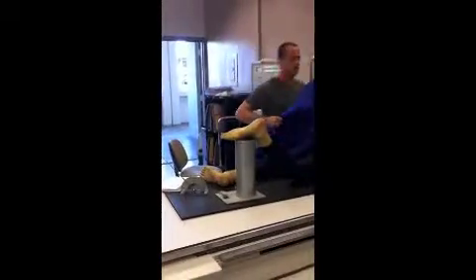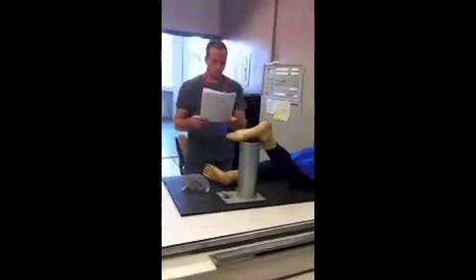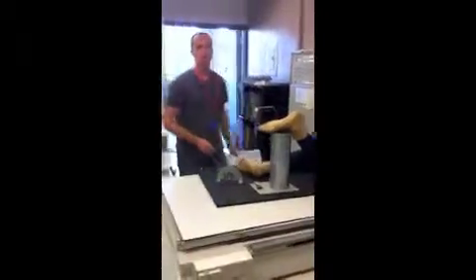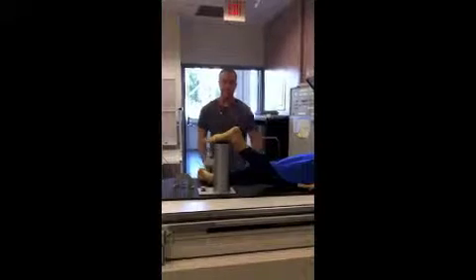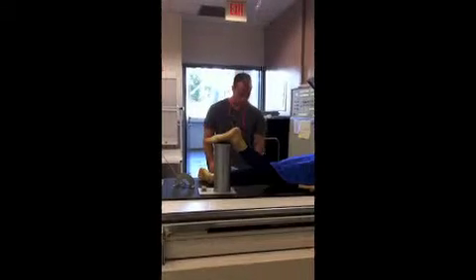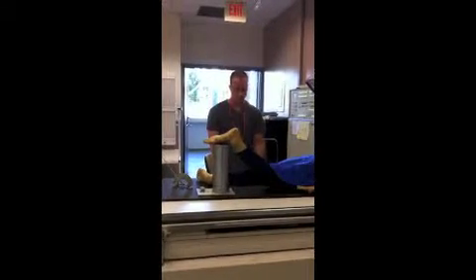Again, shielding the patient as much as possible. And we're ready to take the image. Don't move. And now that we've taken all 7 images for this patient, the 2 of the chest and the 5 of the knee, we take all 7 of our IPs and we go back to the computer workstation.